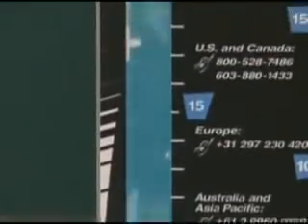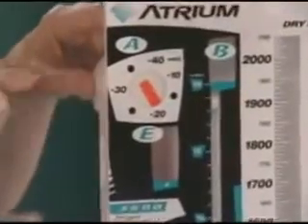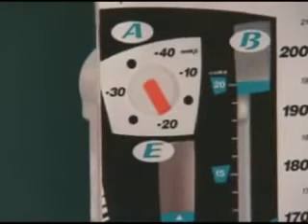In a wet suction system, this chamber uses water to create the negative pressure needed to remove fluid or air. In contrast, a dry suction system uses a built-in device to regulate the suction amount. Generally, dry suction systems are preferred when high negative pressures are needed.